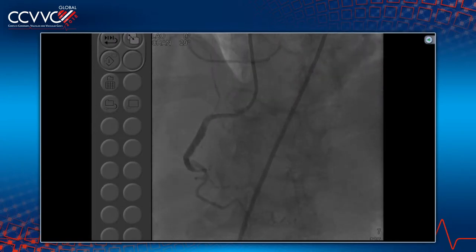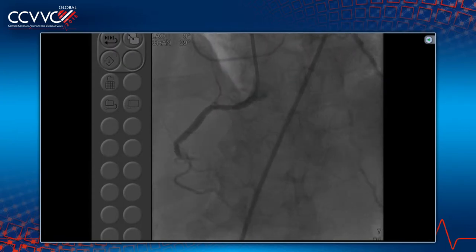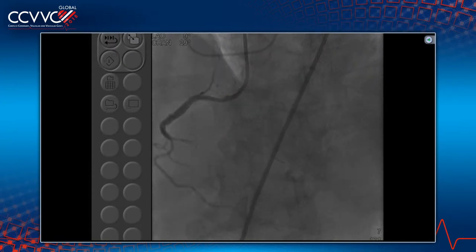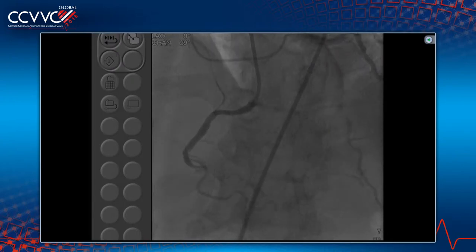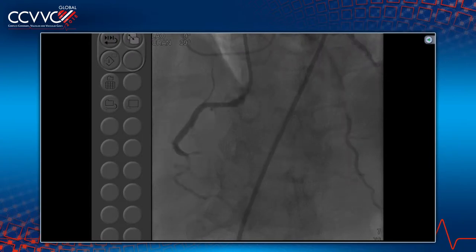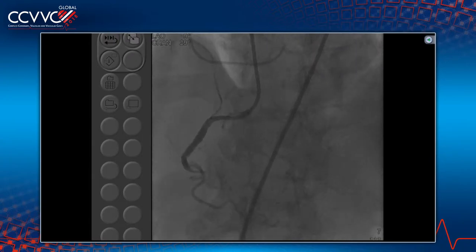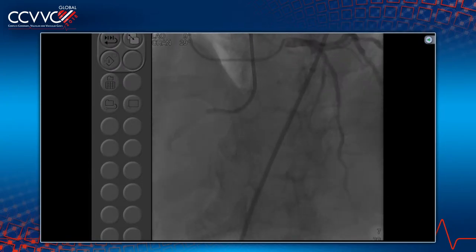Though we mentioned that we'd use a single injection, we did use a left radial to get a dual injection. You do see that his PDA, RPL, and AV continuation fill from the left side. We have a 6 French system. Initially we were thinking maybe we go with 7 French to use a Centercross if we need it, but I think we will start with the 6 French. We have an AL 0.75 and start the CTO work. We go with the Fielder FC and then escalate the wire.